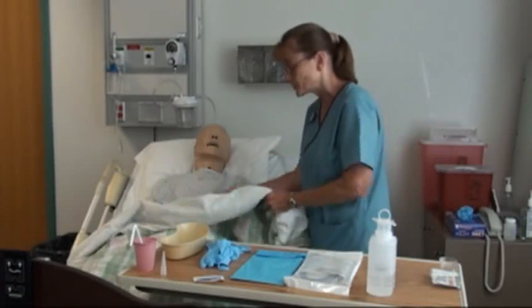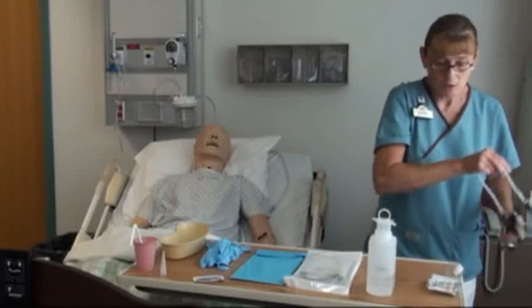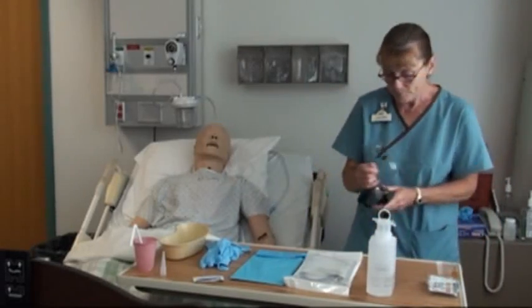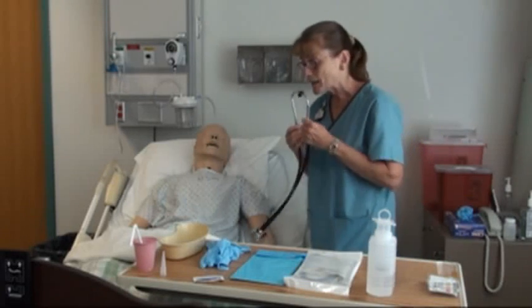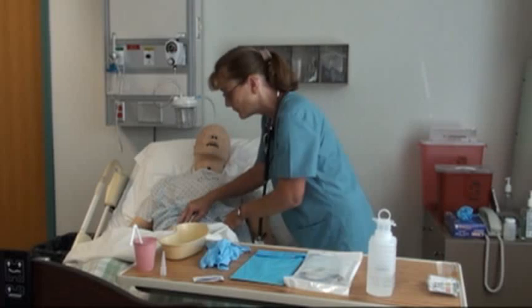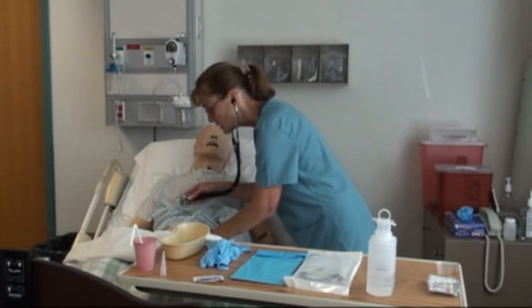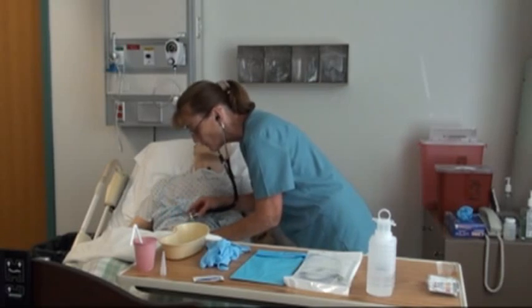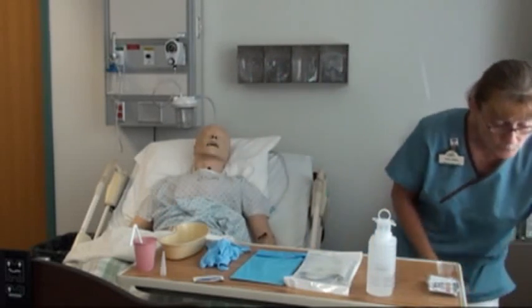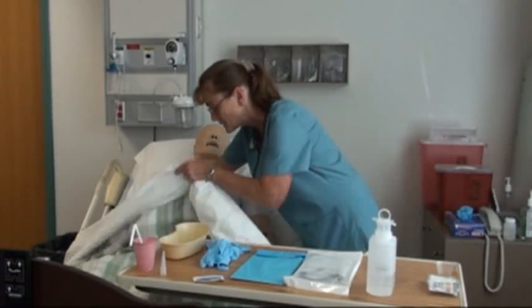Go ahead and listen to her bowel sounds and do an abdominal assessment. Bowel sounds may not be as important if we're just suctioning the stomach, but if we're going to feed, they are important. Look to see if the abdomen is distended, listen to bowel sounds in all four quadrants, and see if any particular area is giving her trouble.